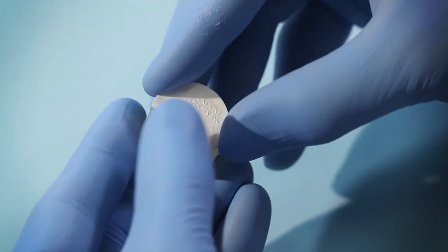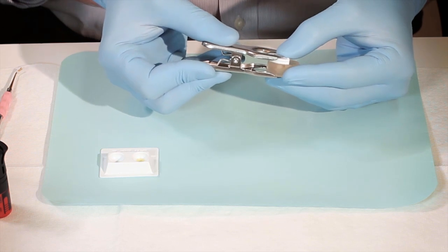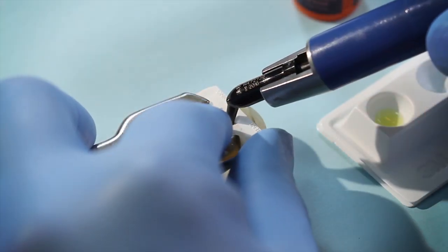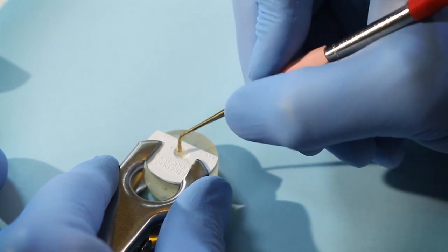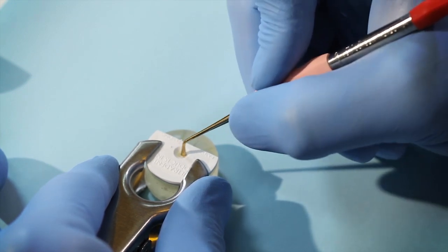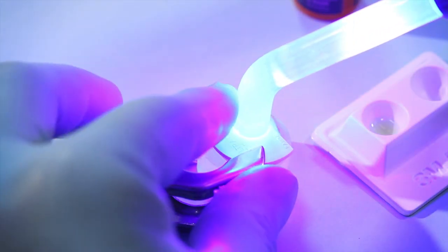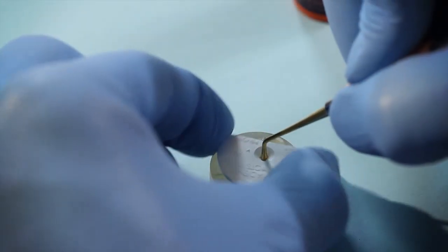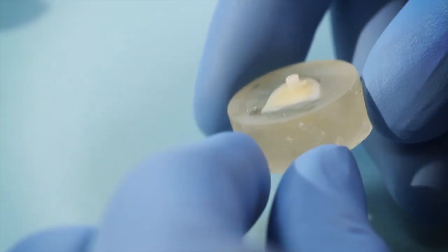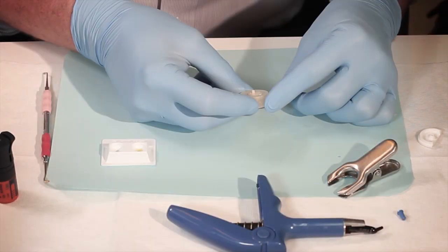Next, a mold was centrally placed on the cured adhesive and fixed into place with a clamp. A hole in the mold was filled and packed down to create good contact with the adhesive and tooth surface, and any excess material was removed. The composite was then light-cured. When the clamp and the mold were removed, the dentist had a test sample — a cured composite cylinder bonded directly onto the surface of the dentin.